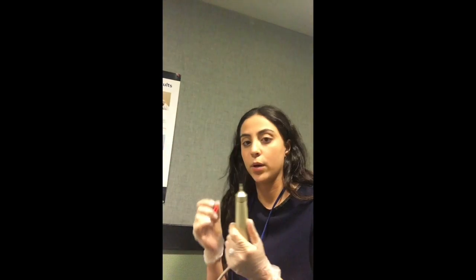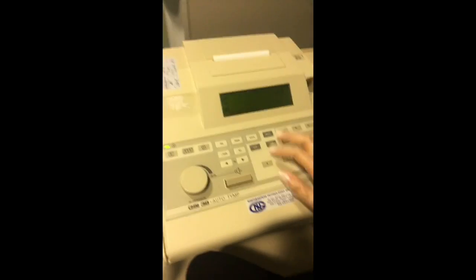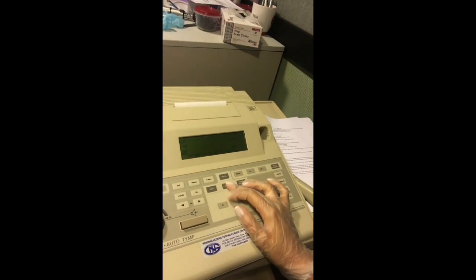This is the piece we're going to use for tympanometric testing. I'm going to put the probe tip right on top, and again this is for infection control because we don't want to put it from ear to ear — these are later cleaned before they are used again. We're going to set TYMP on the audiometer and start with the right ear by pressing the R button.